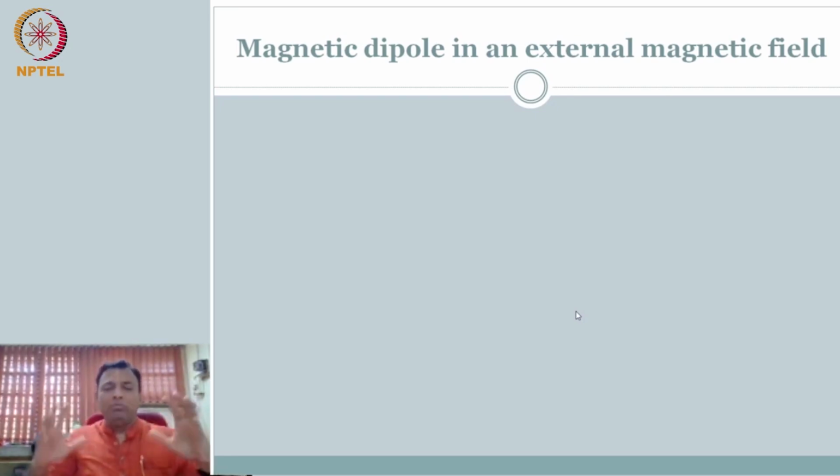So somehow the whole scheme in magnetic resonance imaging is how do we manipulate, how do we generate these magnetic moment vectors. Of course, by virtue of having hydrogen and its own spin, there is some microscopic magnetization vector that is there. But how do we manipulate it so that we get some signal out of this? How do we get some measurable quantity? Because with a random distribution, it is zero otherwise. So how do we engineer it to our advantage? That is the whole idea. So how do we do that?